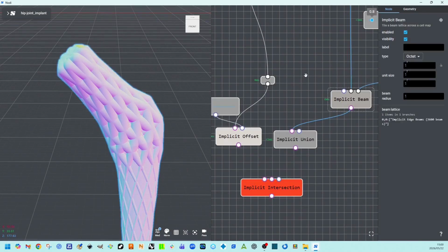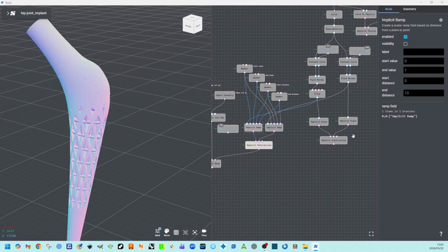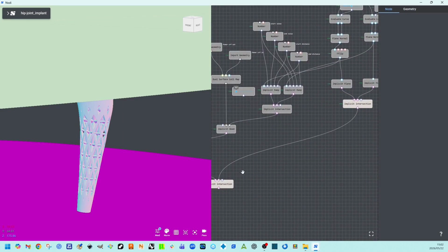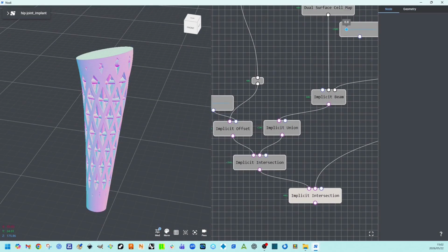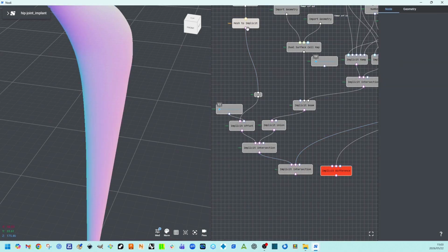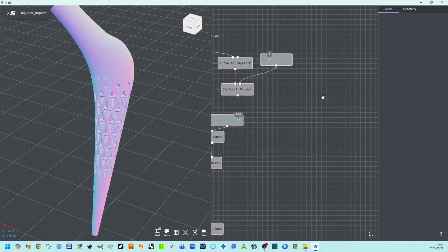Now we assemble the booleans. Implicit union joins the thickened shell with the lattice. Implicit intersection clips the result against the ramp field, so the lattice only appears in the middle band. To carve out the inner cavity, we add an implicit difference. With these booleans in place, the entire stem updates parametrically.